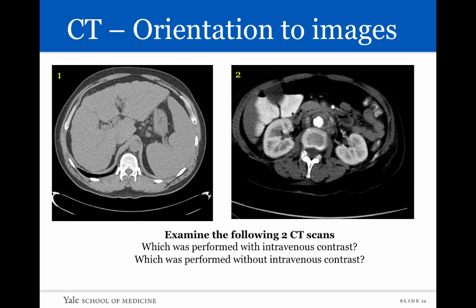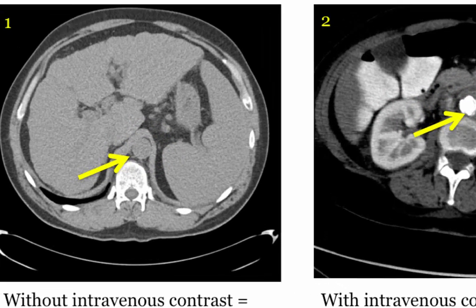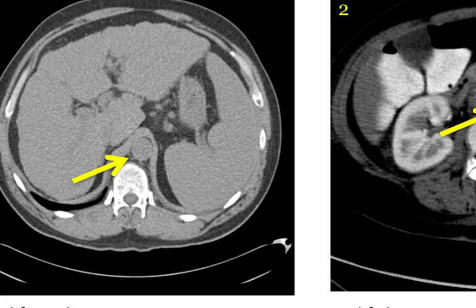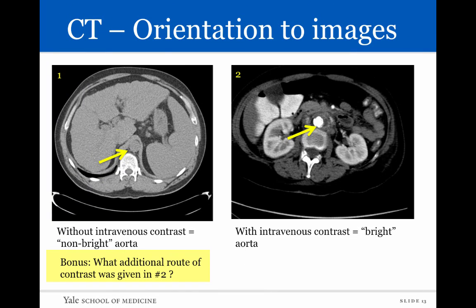Looking at these two CT scans, one patient was given intravenous contrast and one was not. The first scan is without intravenous contrast, and the second is with intravenous contrast. The aorta in the mid-portion of the non-contrast image looks exactly like the liver, spleen, or muscles — the same shade of gray. When contrast is given, it appears very bright — very white — on CT imaging. In the second scan, oral contrast was also given, which appears bright and is seen within portions of the patient's bowel.